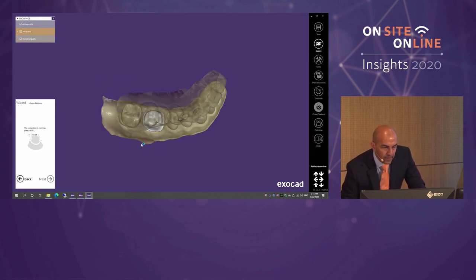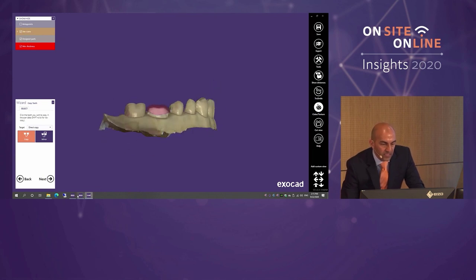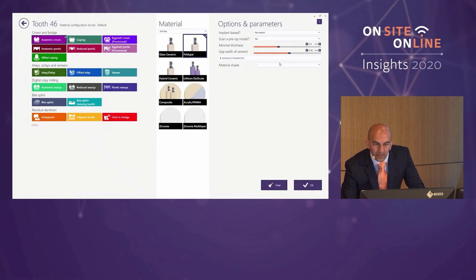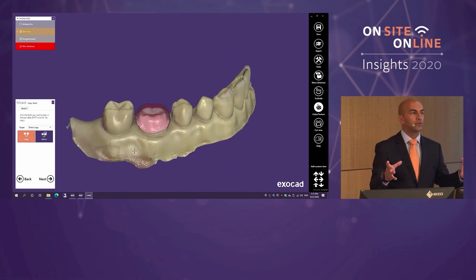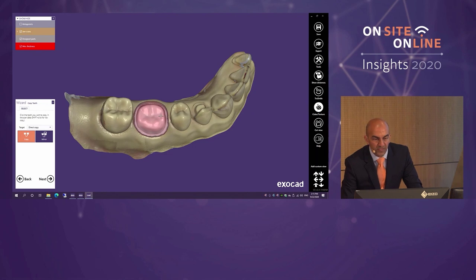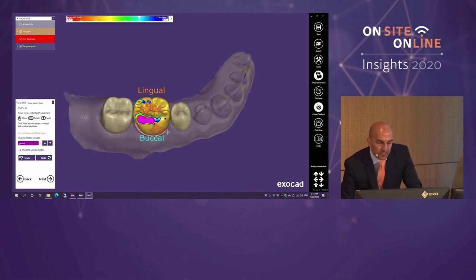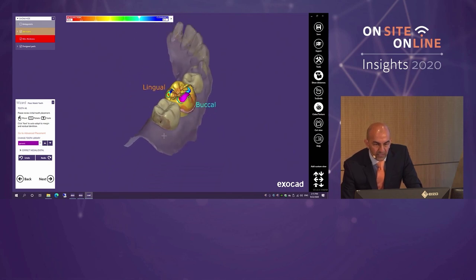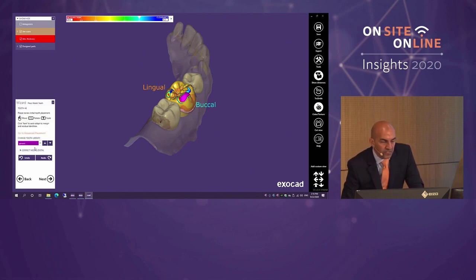We mark our insertion axis and hit Next. Parameters kick in — one of them being minimum thickness. Opening DB and clicking on 46 shows those parameters, now represented graphically in the CAD software. At this point, if we had contralateral data we could copy the tooth from the other side, or even copy the 7 into the 6. The software proposes a tooth restoration from our tooth library. Every installation of Chairside CAD gets 12 different tooth libraries available, defaulting to the one called Generic.